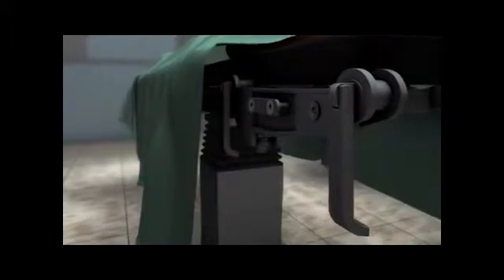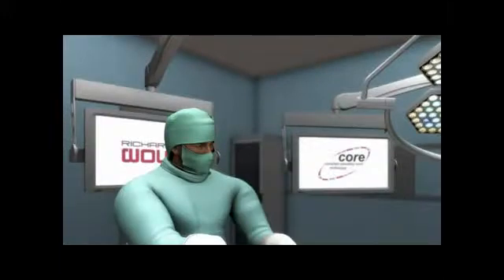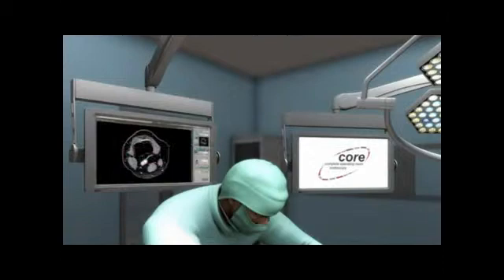Core delivers wireless control for the operating table in the Core operating theatre. Patient data has meanwhile already been loaded from the KIS system. Preoperative diagnostic data such as CT, MRI or X-ray are received from PACS and then displayed to the surgeon on the appropriate monitor.